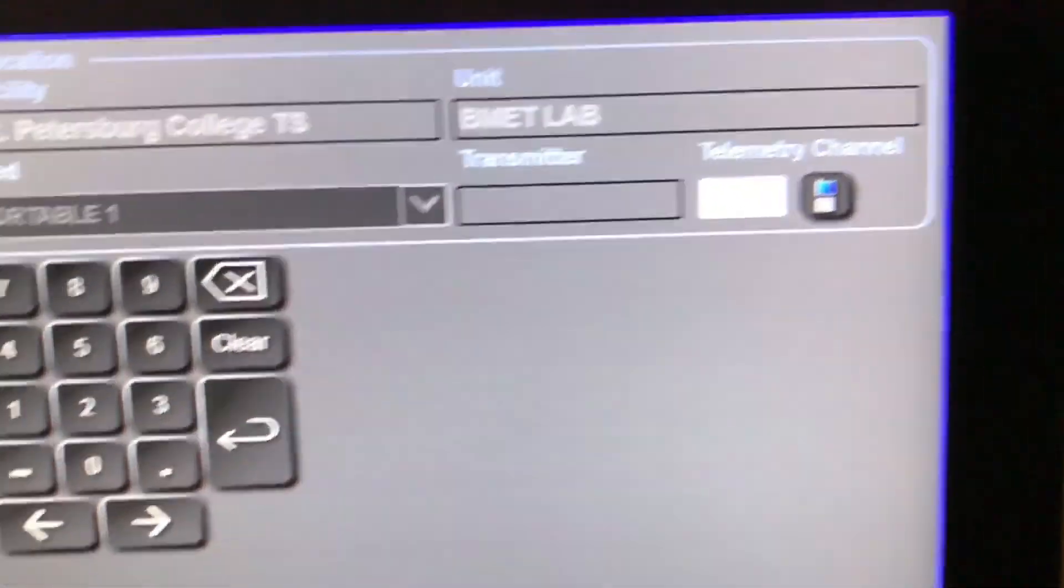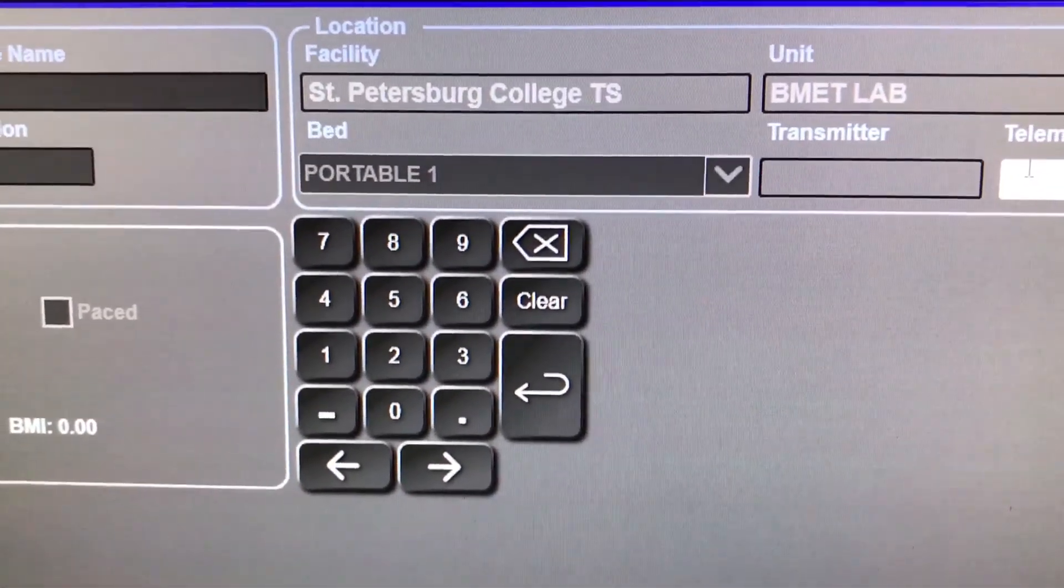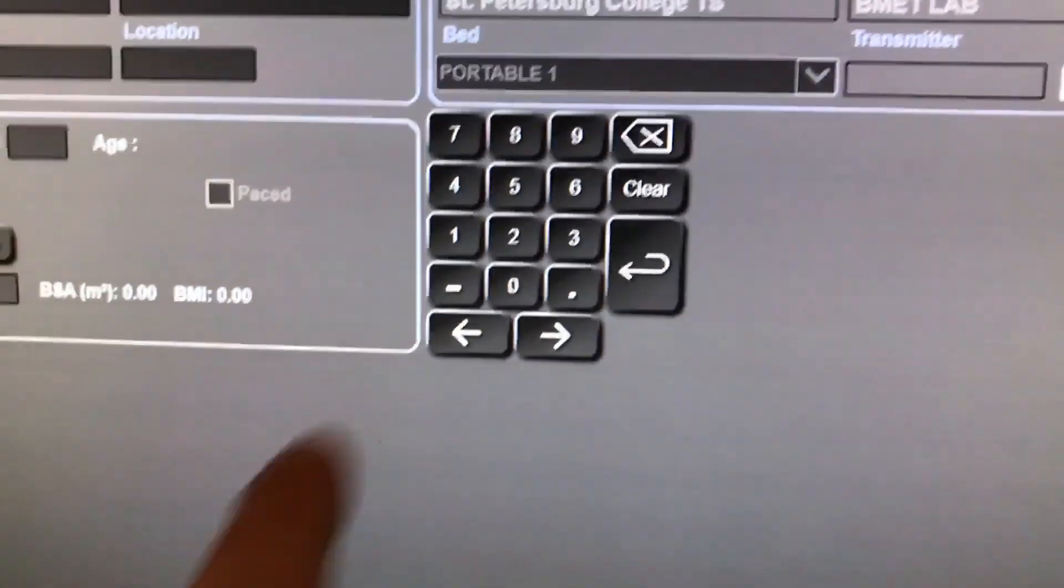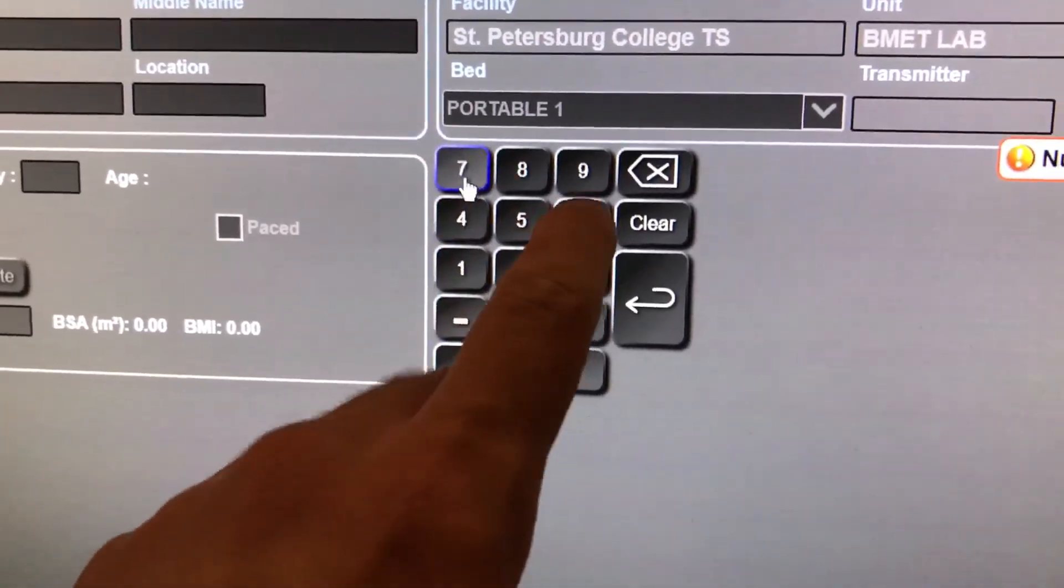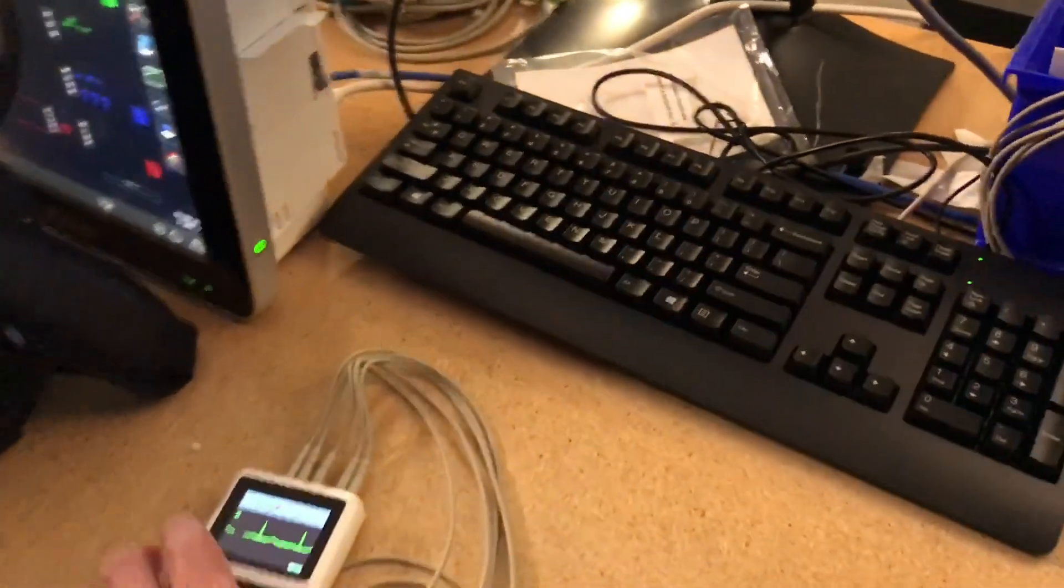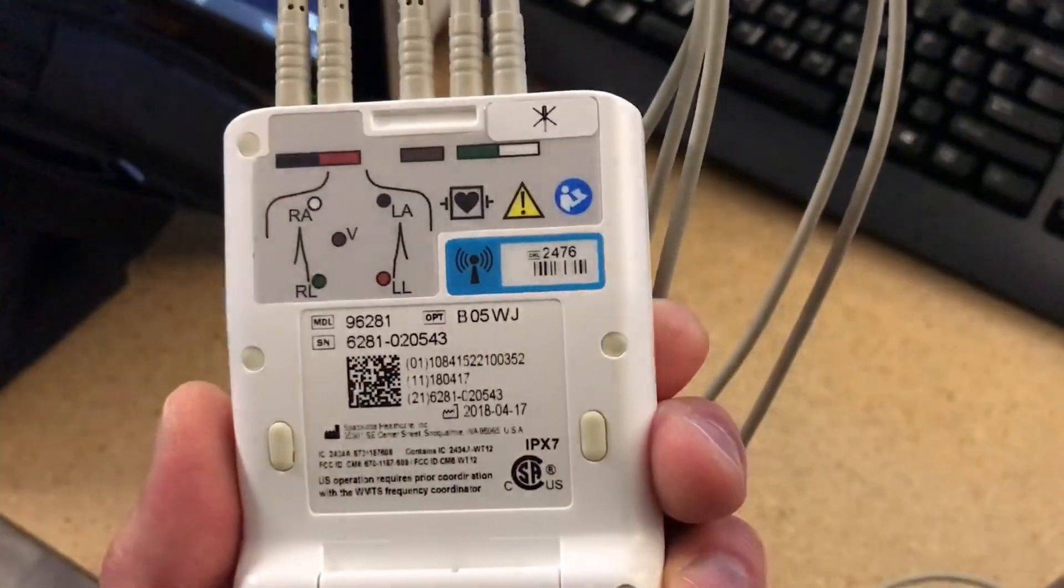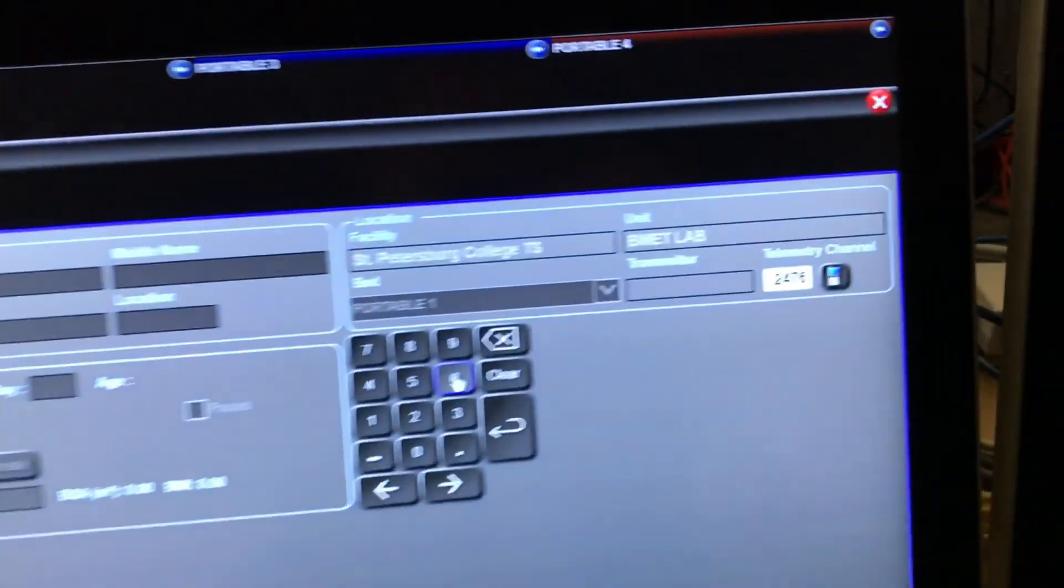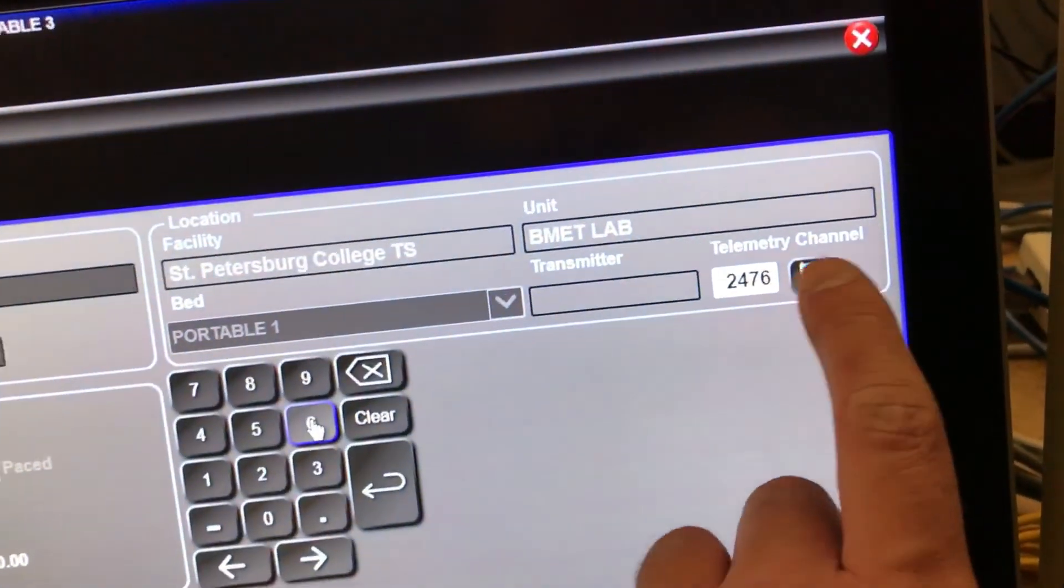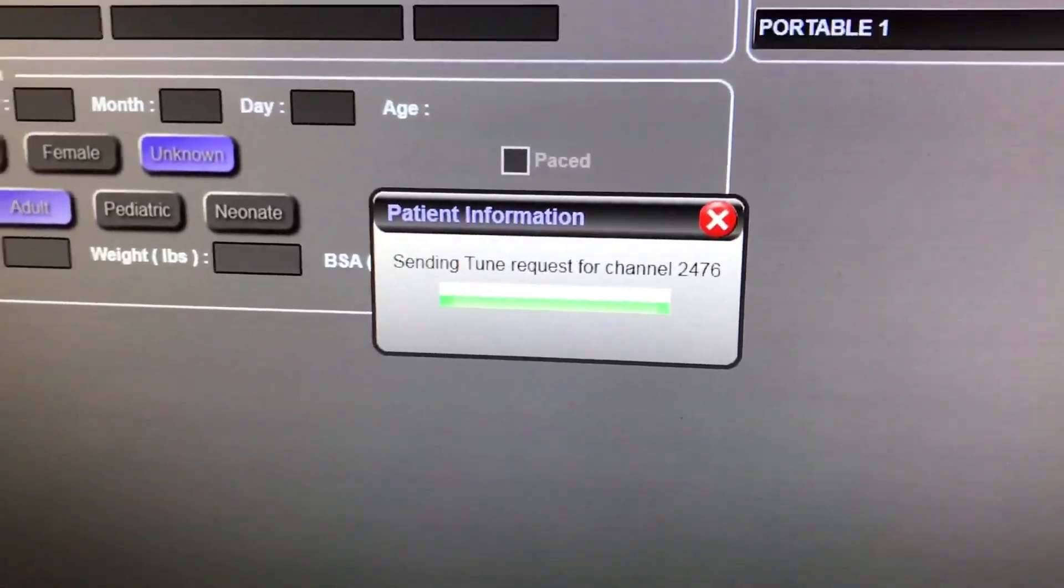So you want to click on that. You'll get the option to enter in the channel number. In this case, it's 2476. And it's going to be different on each one of these. So you definitely want to look in the back of these and make sure you have the correct number. It's always going to be in that blue box there. Then you hit the button here and it'll say sending tune requests.